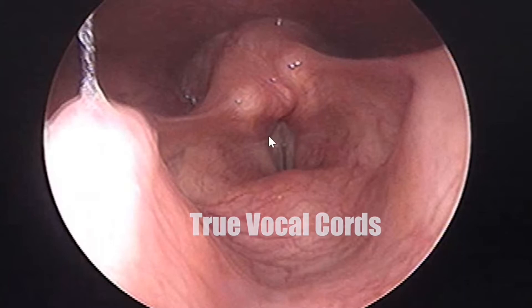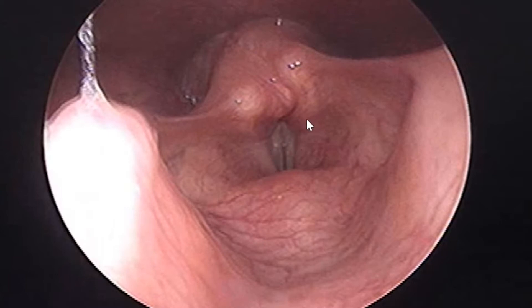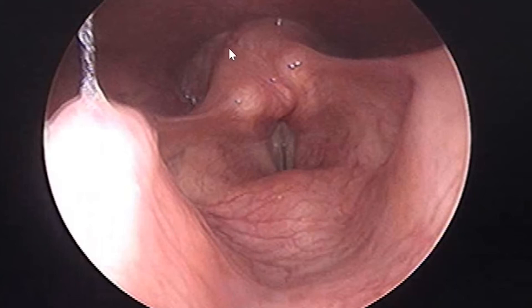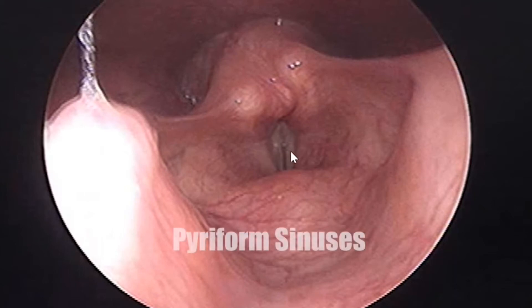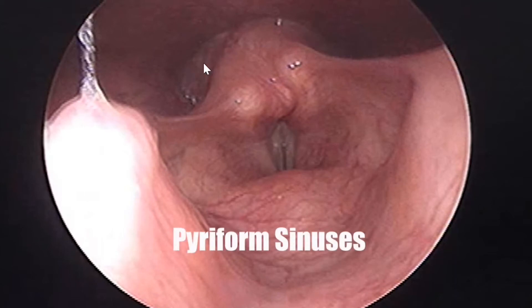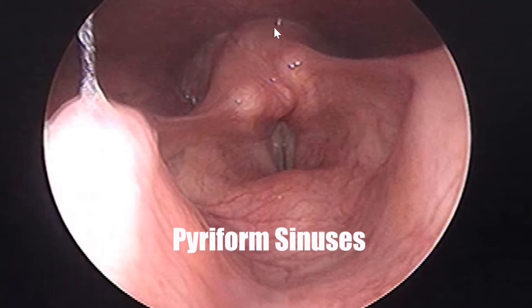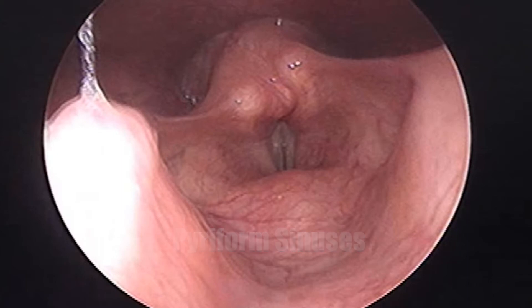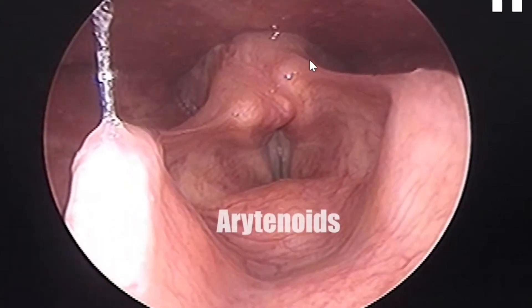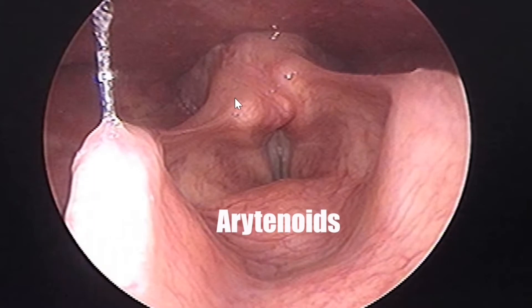Above the vocal cords are the false vocal cords, which sometimes close forcibly in a falsetto voice or in persons who distort their voice. These are the pyriform sinuses, through which food passes — air passes from the trachea to the lungs, while from the pyriform sinuses food passes to the esophagus. Food enters from both sides, and these two bumps are the arytenoid cartilages, which form part of the larynx or voice box.